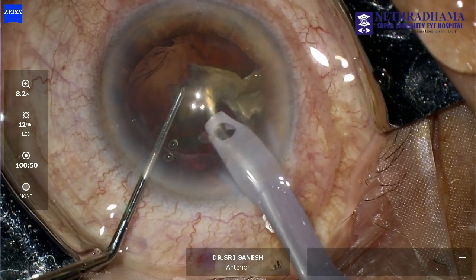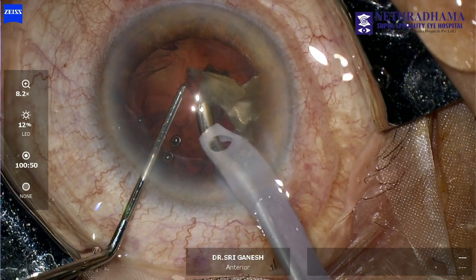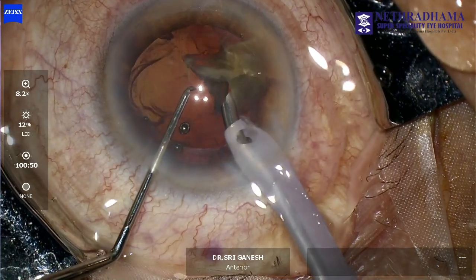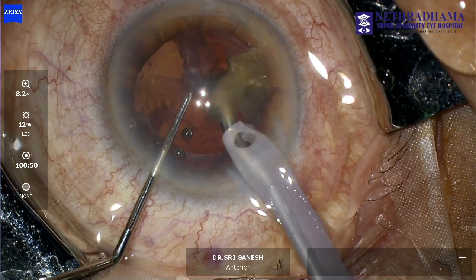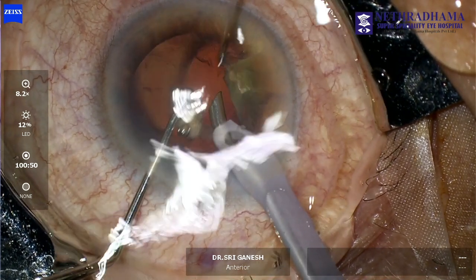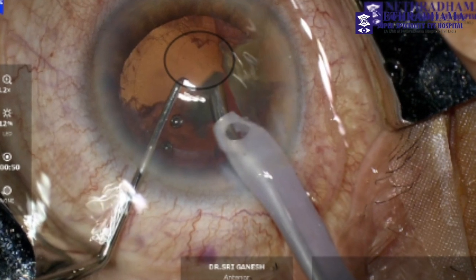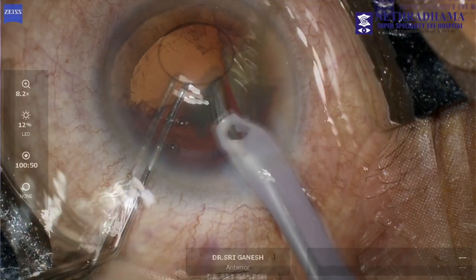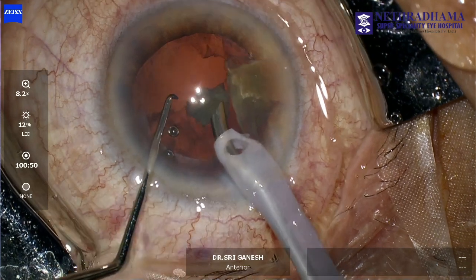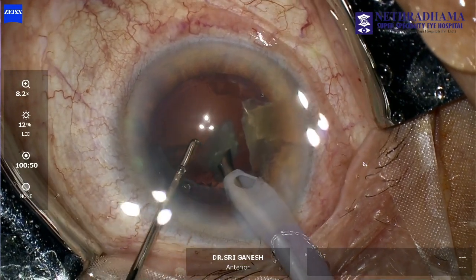Now there is a sudden surge when I am removing the last fragment and then the PC suddenly comes up and there is a punched-out PCR because the PC has hit the phaco probe. Now you should be very careful.